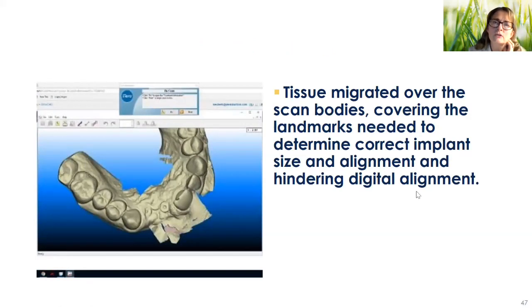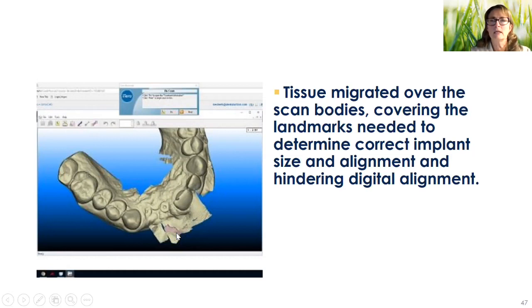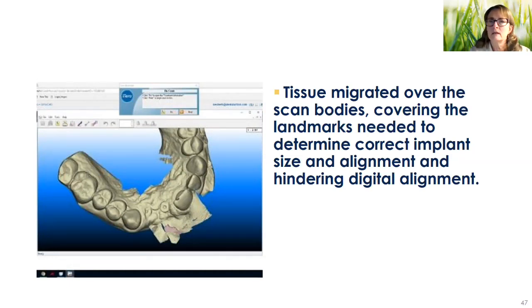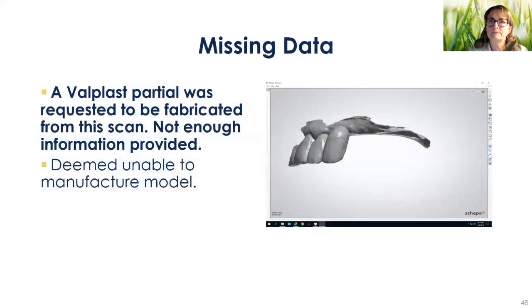Here the tissue has actually migrated over the scan body. A scan body is needed for digital impressions. Part of what occurred is they probably captured the inside of the lip there and it misaligned the data. This was a real case that came in for a Valplast partial and there's just not enough information.